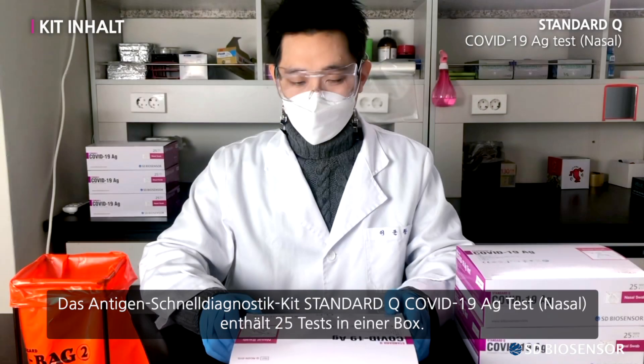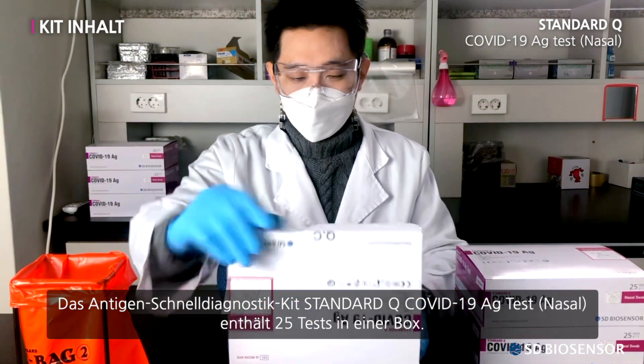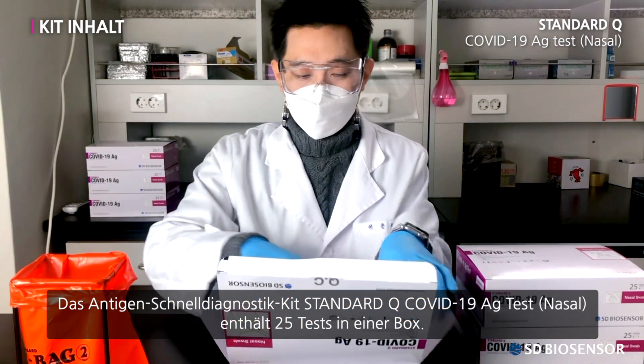Rapid Antigen Diagnostic Kit — Standard Q COVID-19 AG Test, Nasal. Contains an amount for 25 tests in one box.